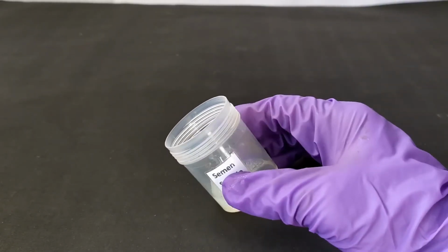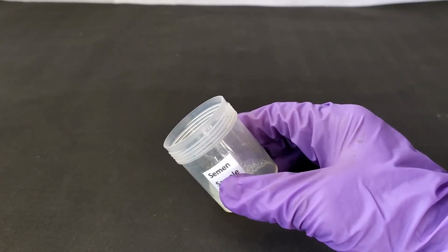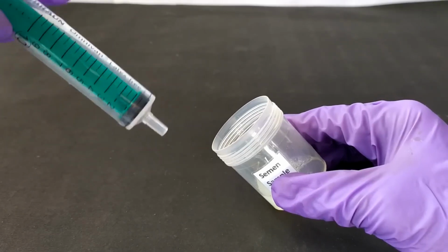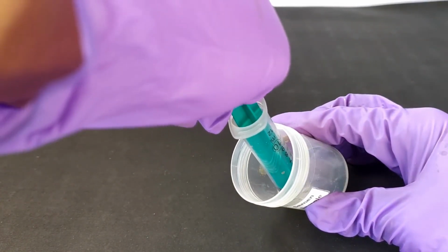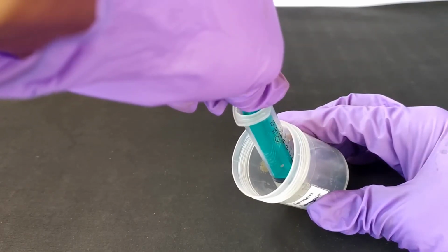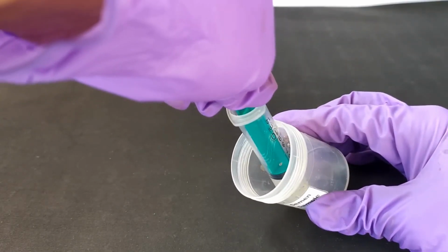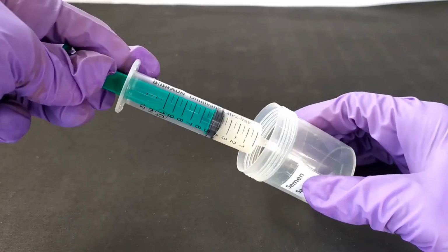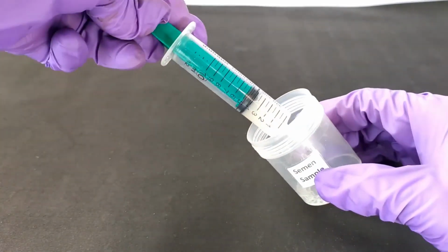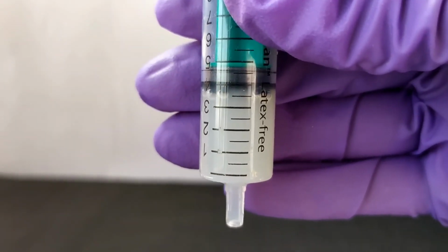An alternative method of measuring semen volume is to directly aspirate the liquefied semen sample into a 10 cc needleless syringe. After positioning the container in a slanting position for a couple of minutes prior to aspiration, make sure to aspirate completely till the last drop, while at the same time taking extreme care not to aspirate any air bubbles. Note down the volume as before. Add a volume of 0.5 ml to the observed volume in order to compensate for the semen sample stuck to the walls of the collection container.